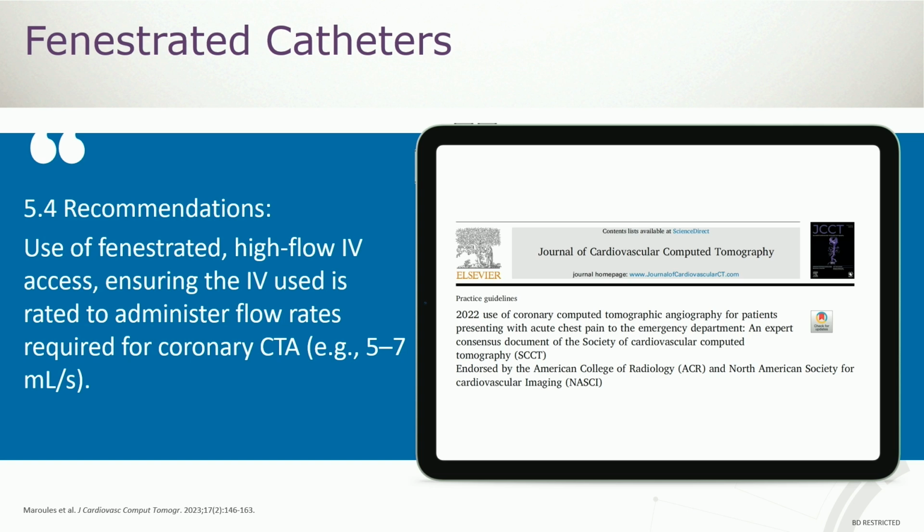What is recommended, and this is a guideline statement in 2022 on coronary CTA in the emergency department, and you may or may not be aware of this, is to use fenestrated high-flow IV access catheters, especially when performing CCTA. This is really going to help increase the attenuation in the vasculature and give you much higher attenuation, or much higher contrast to noise, when you're actually looking at your images.